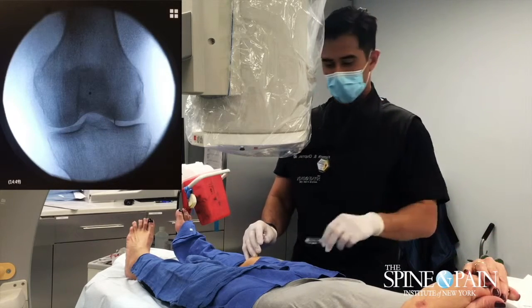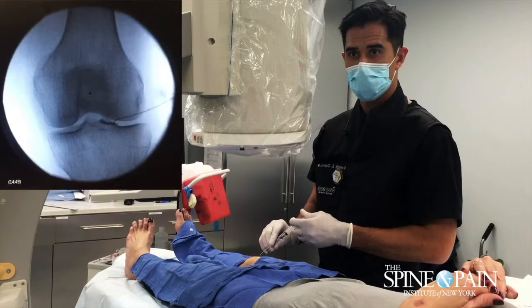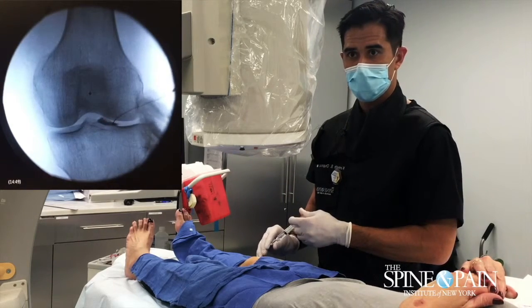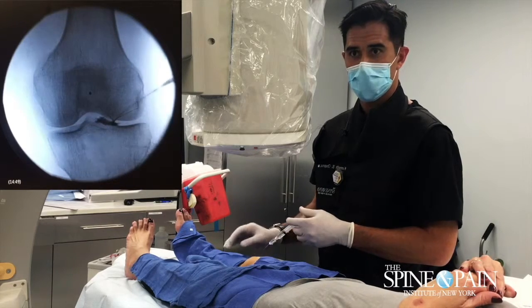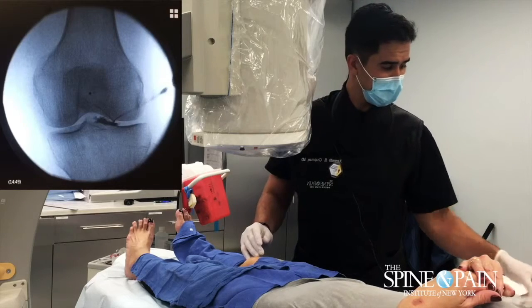I'm going to inject some contrast. We don't have any allergies to this. This is going to spread. You can see it going right in that space, exactly where we want it. Sometimes you see it spread up and down inside of the bursa there.